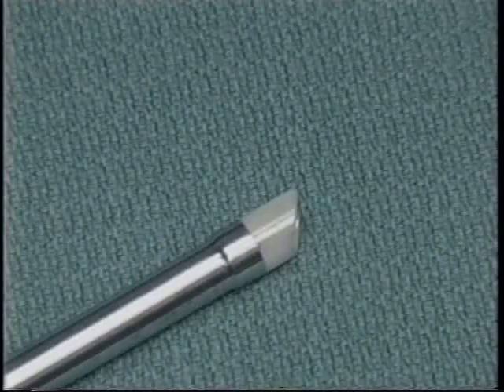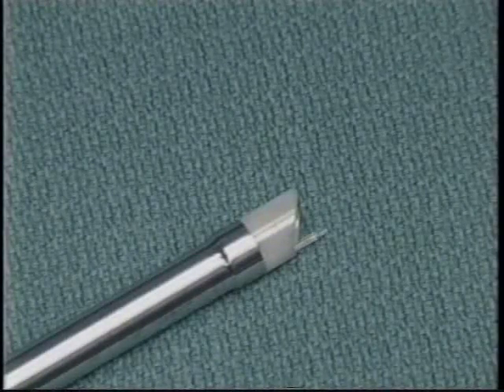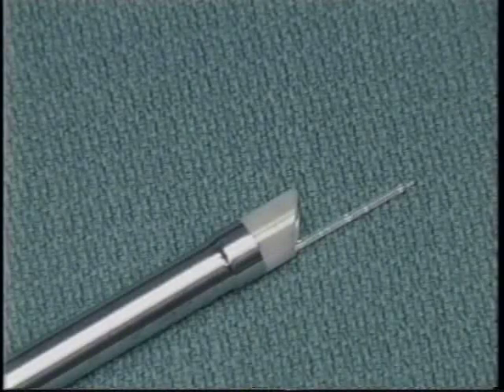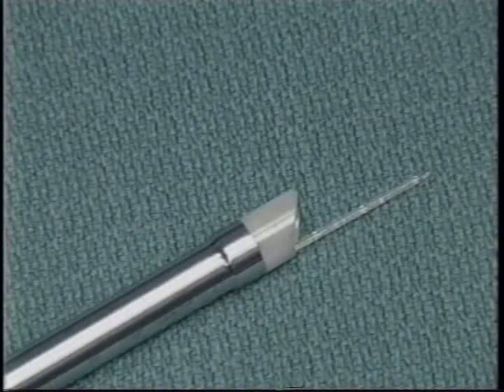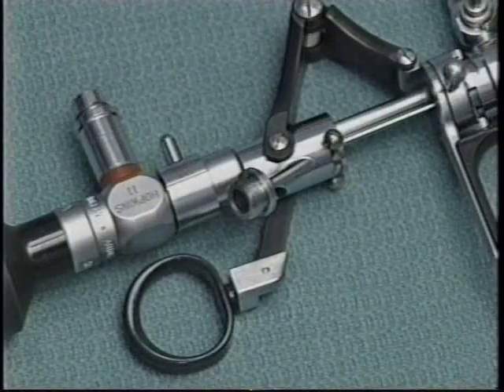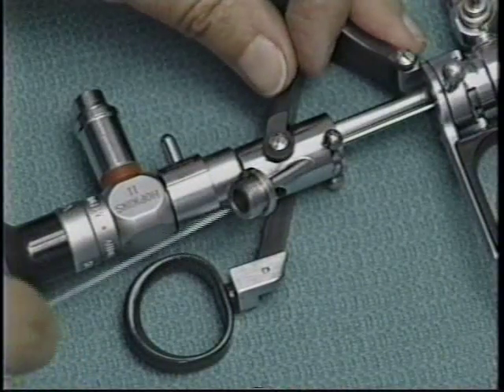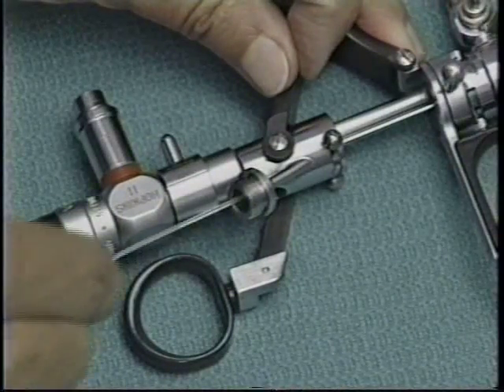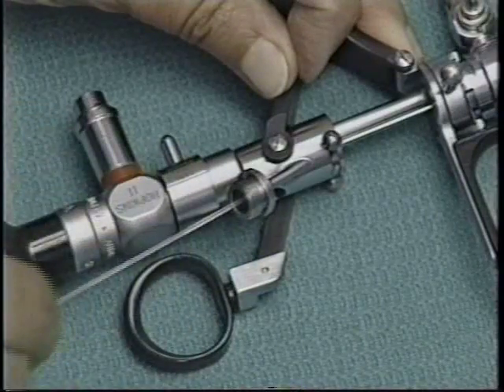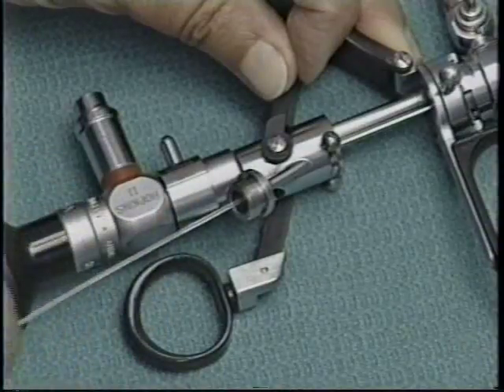For holmium laser treatments, a 550 micron bare fiber is used, which is very economical, costing only approximately $10 per patient. We prefer to use the McPhee modification of a standard Iglesias Stortz 26 French resectoscope for most of our holmium laser procedures.